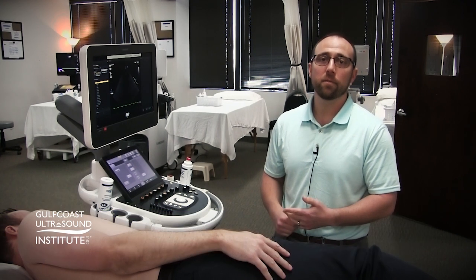I'm Steve Walling here at Gulf Coast Ultrasound Institute, and today for your hot tip we will be going over an apical sweep to look at the left ventricular apex.